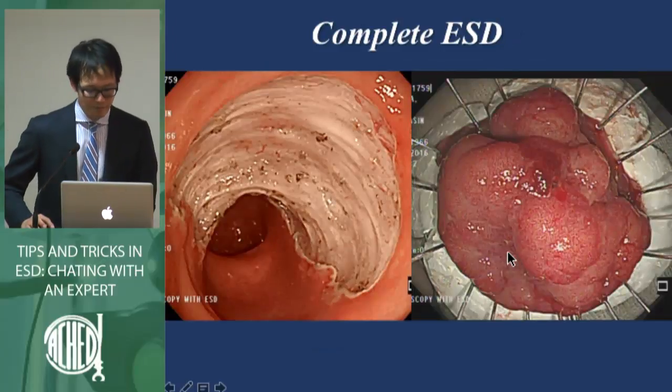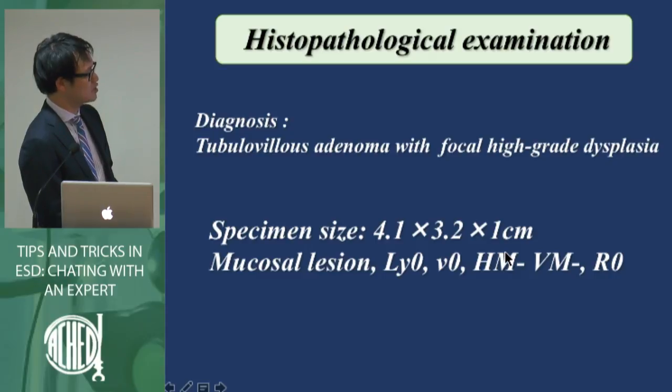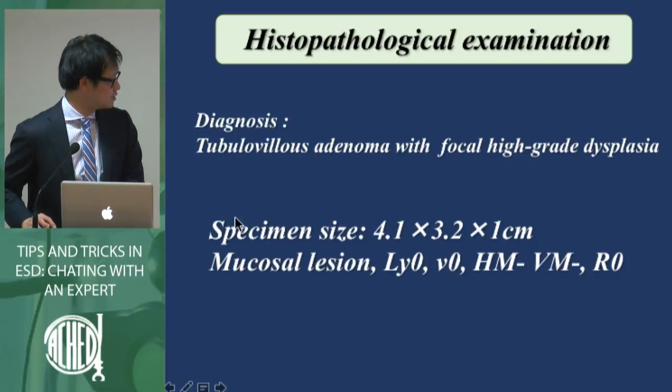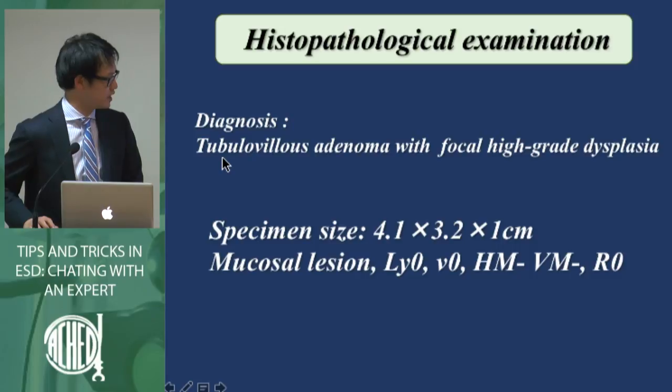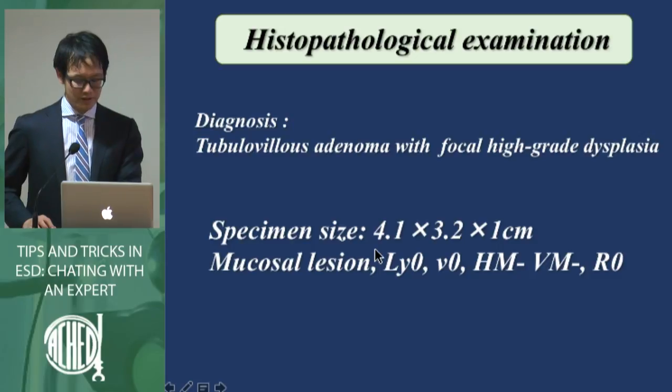So, like this. With ESD, it's important that histopathological examination can get high quality en bloc dissection specimens. So we evaluate the details of the specimen. This final report is a tubulovillous adenoma with a focal high-grade dysplasia. The size is 4.1 by 3.2 centimeters.